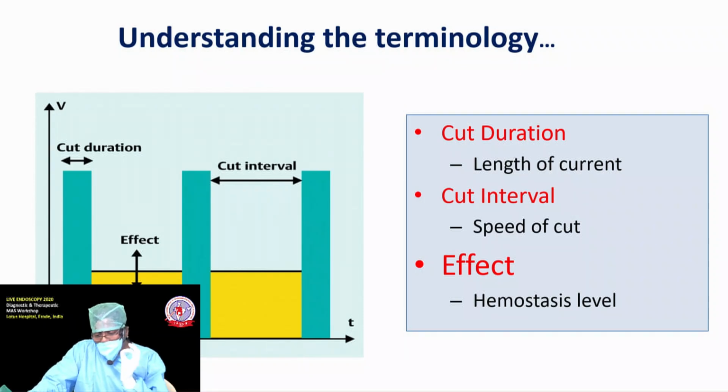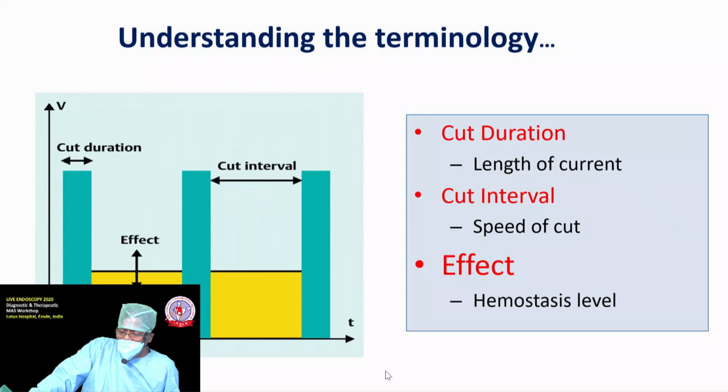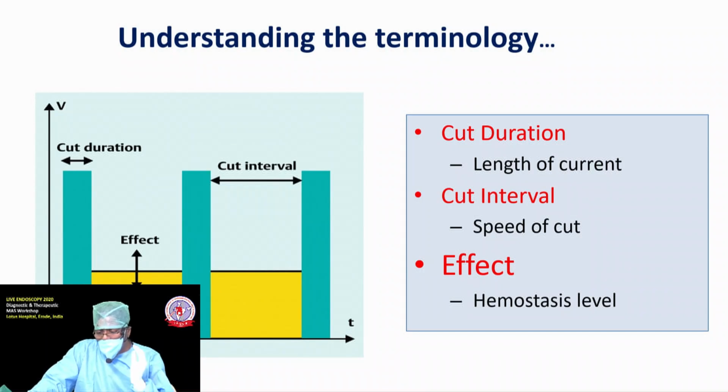So you can have a precise effect on the tissue by intelligently managing this. But the machine with a brain acts for you. That's why we say tissue responsive. It is nothing but brain inbuilt, artificial intelligence is there.